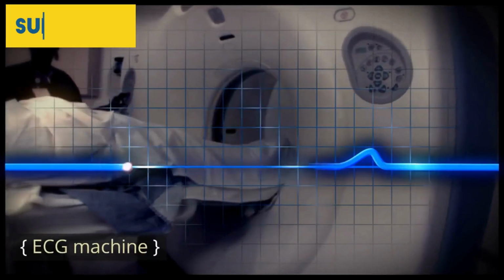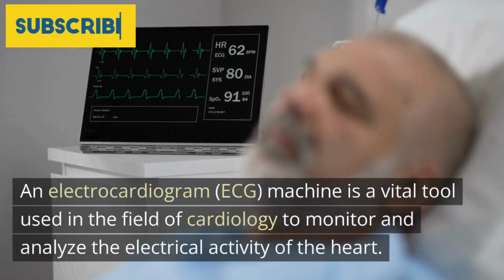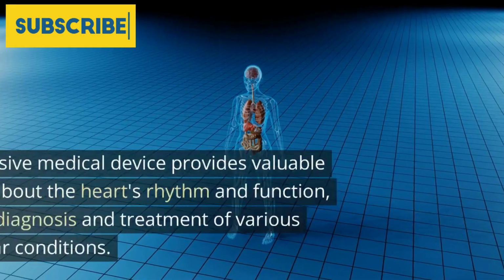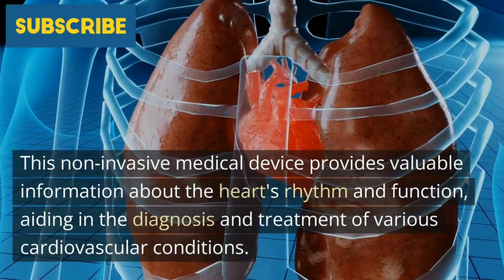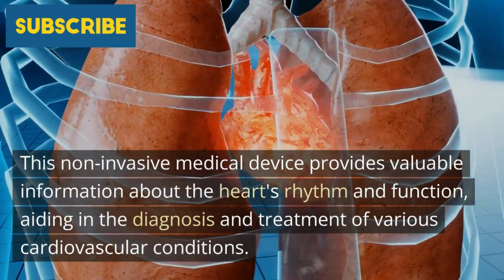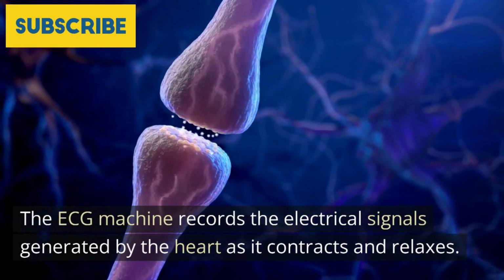ECG machine. An electrocardiogram, ECG, machine is a vital tool used in the field of cardiology to monitor and analyze the electrical activity of the heart. This non-invasive medical device provides valuable information about the heart's rhythm and function, aiding in the diagnosis and treatment of various cardiovascular conditions. The ECG machine records the electrical signals generated by the heart as it contracts and relaxes.